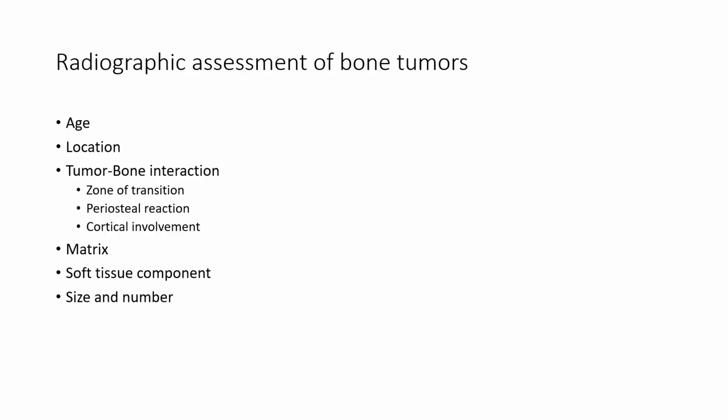So remember age, location, the tumor bone interaction, the matrix, presence or absence of a soft tissue component, and the size and number of lesions can be helpful in your radiographic assessment of bone tumors.